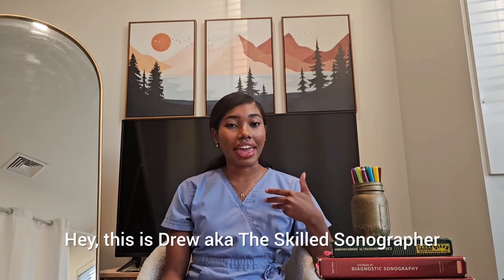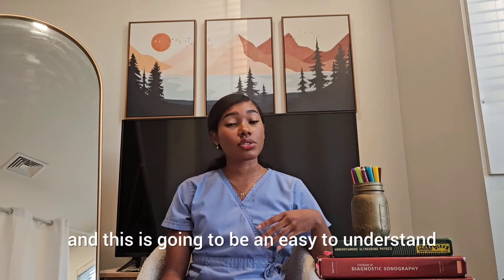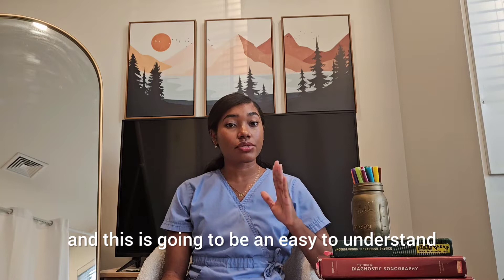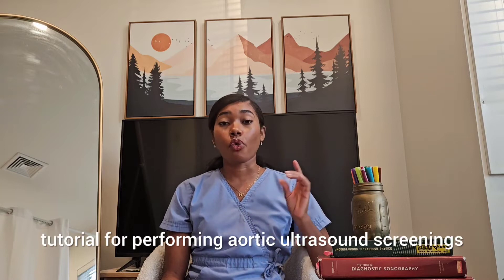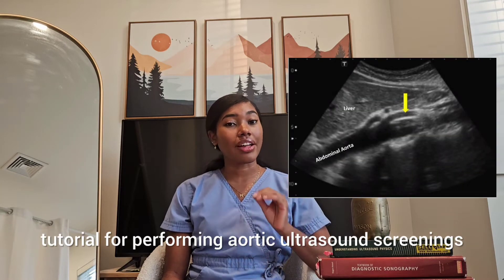Hey, this is Drew, a.k.a. The Skilled Sonographer, and this is going to be an easy-to-understand tutorial for performing aortic ultrasound screenings.